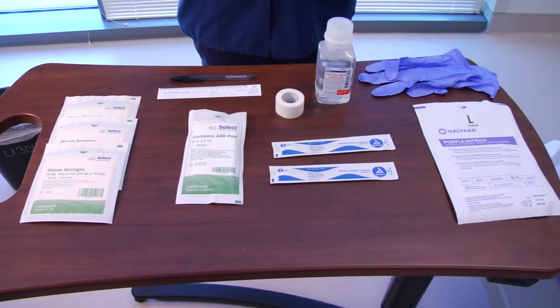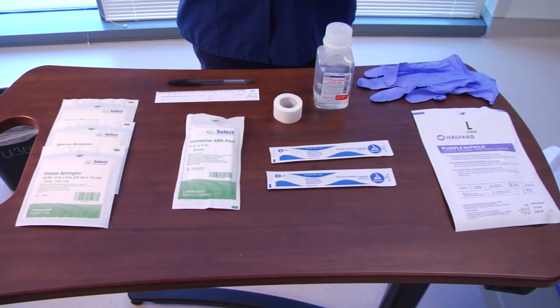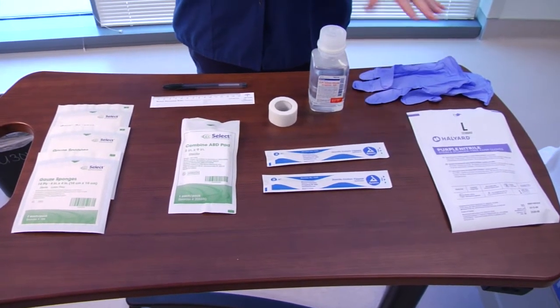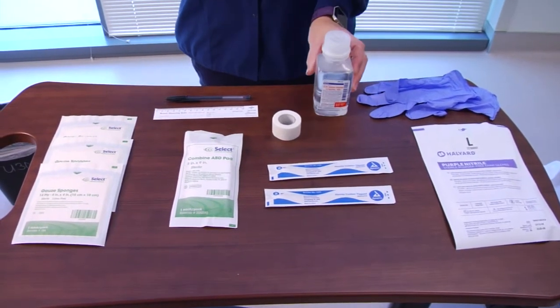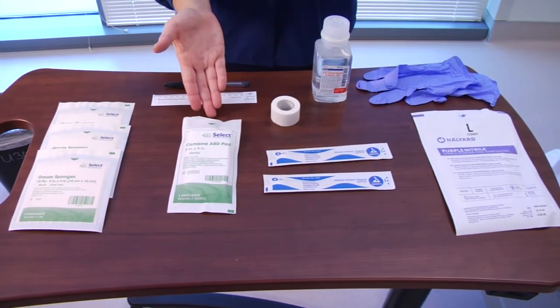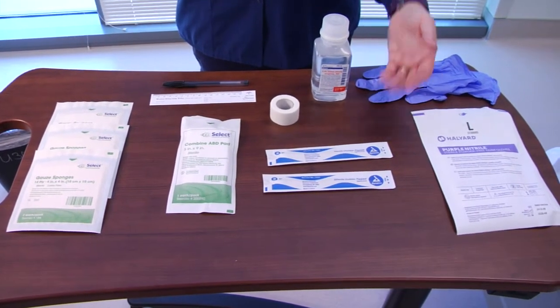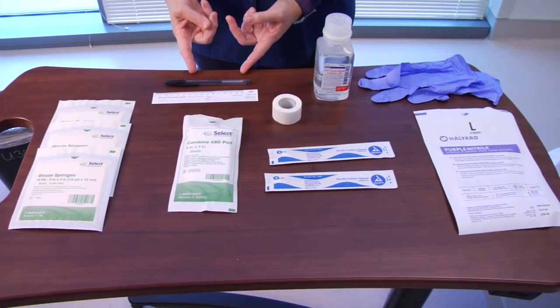Prior to re-entering the room, the nurse will gather the necessary supplies. In this case, the nurse will need clean gloves, sterile gloves, normal saline, sterile gauze dressing sufficient to cleanse, pack, and cover the wound, an ABD pad, sterile cotton-tipped applicators, a measuring tool, tape, and pen.